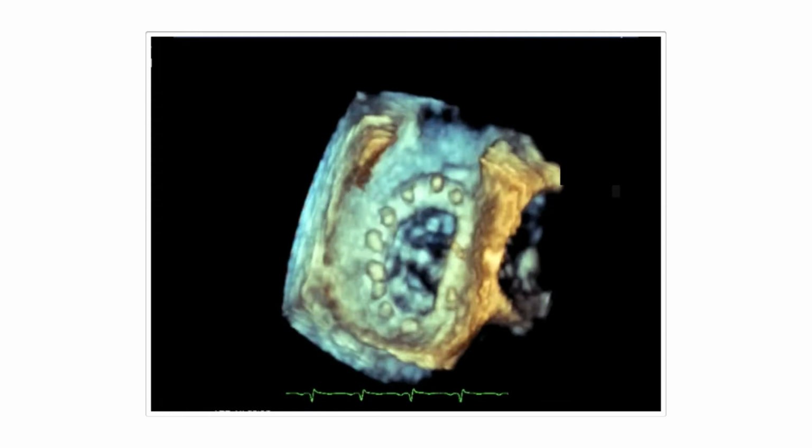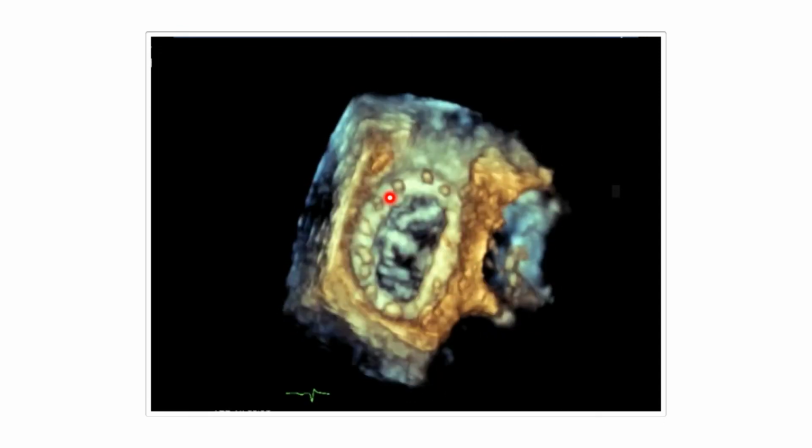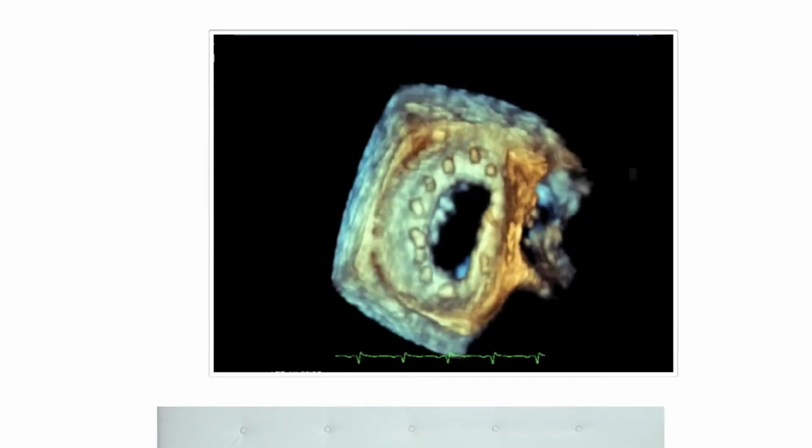You don't need anticoagulation. And if you repair the valve, in all cases you also implant a so-called annuloplasty ring. There are different models out there which look a little bit different, but this is the key feature that you'll also be looking for on the echocardiogram. And this is how an annuloplasty ring looks in 3D. A fascinating image. You can even see where the sutures have been placed.